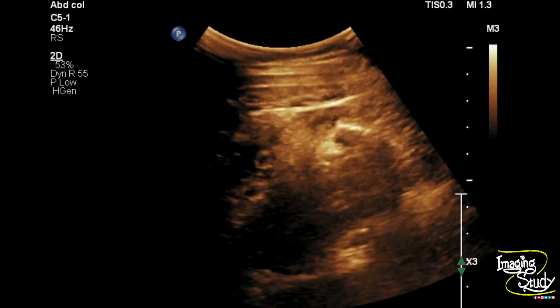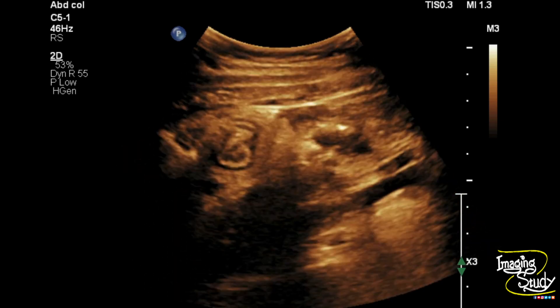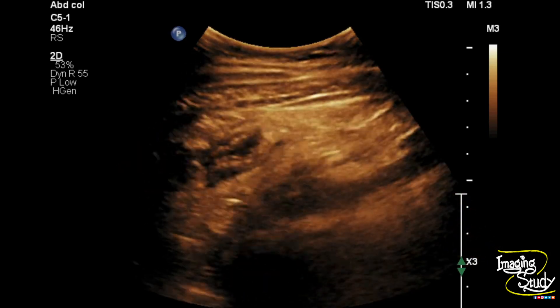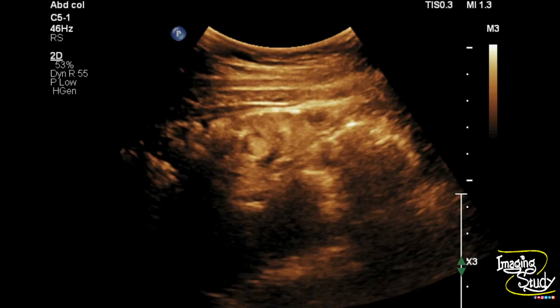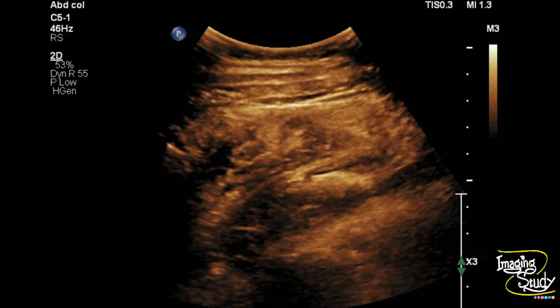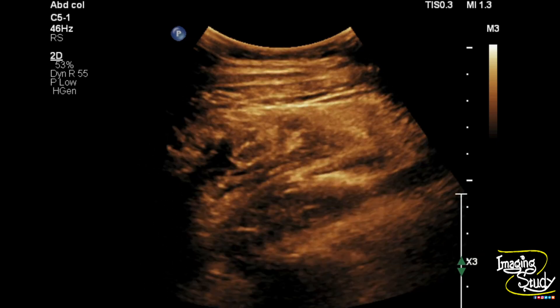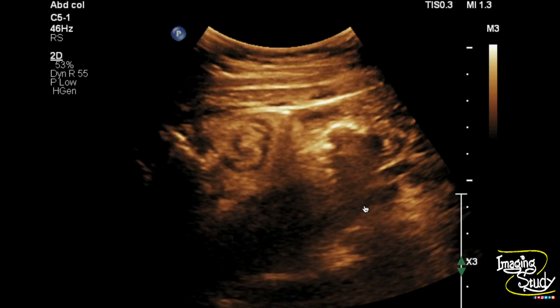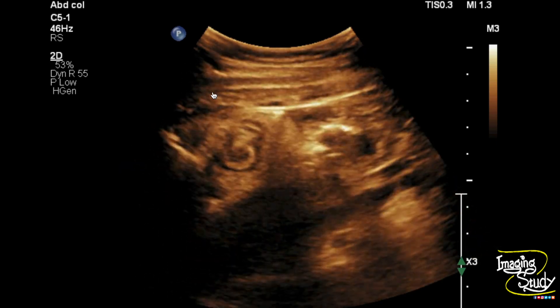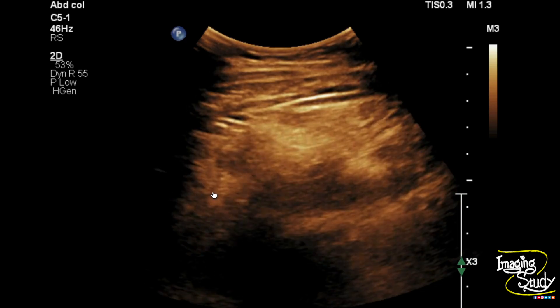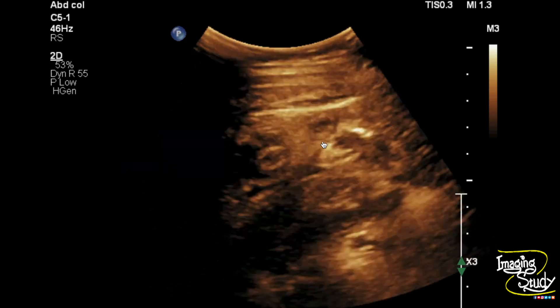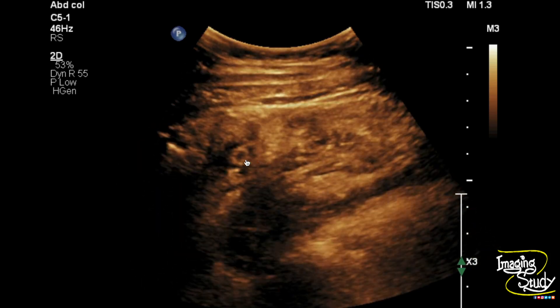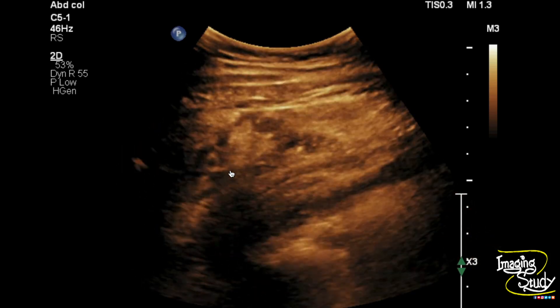Here you can see the curvilinear transducer view of the right iliac fossa. You usually don't see acute appendicitis on the curvilinear transducer — you should go for the linear transducer or high-frequency ultrasound. But sometimes with the curvilinear transducer we can see the dilated appendix. You can see the iliopsoas muscle and the anterior wall muscles, and in between them an area of increased echogenicity — that is the fat stranding region — and central to this area you can see a tubular structure, which is nothing but the dilated appendix.